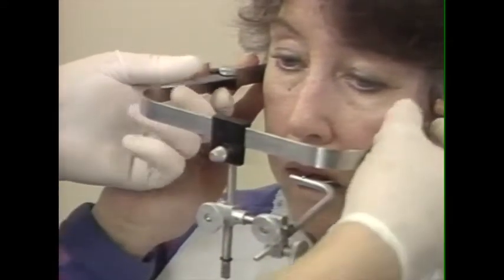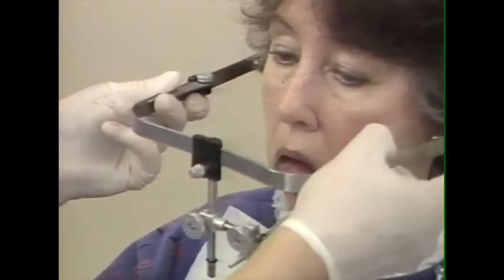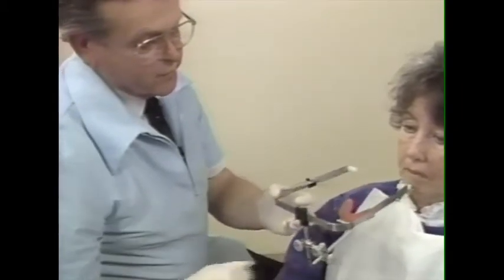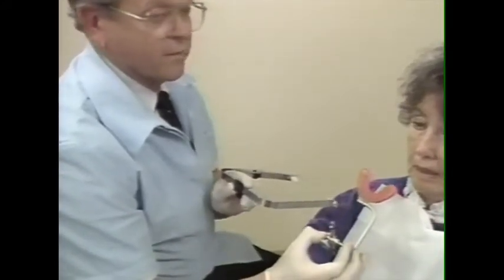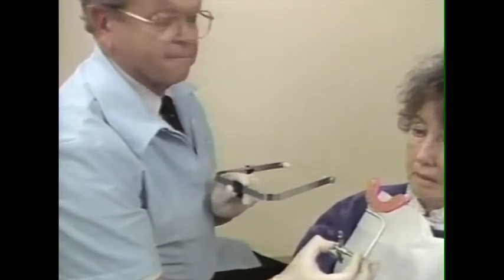We're now ready to remove the face bow from the patient. We open, please, and slide it out of the mouth. And that completes our face bow record. We can now remove the record from the face bow, and this is what we use to transfer the cast to the articulator.